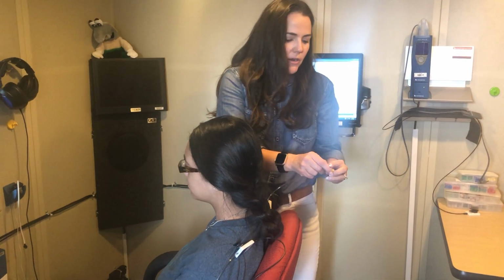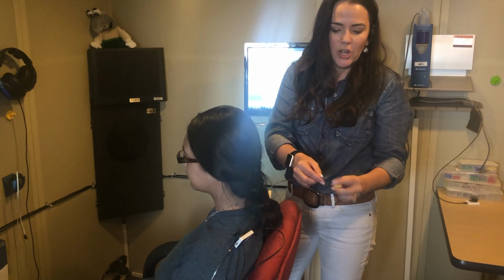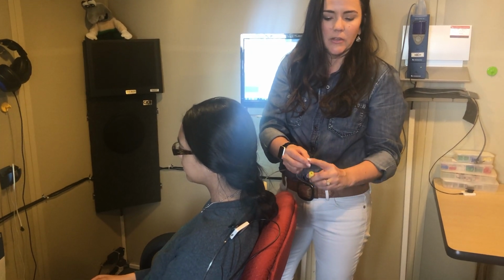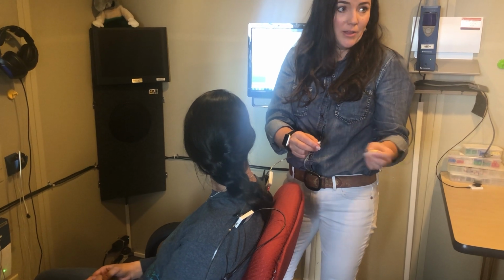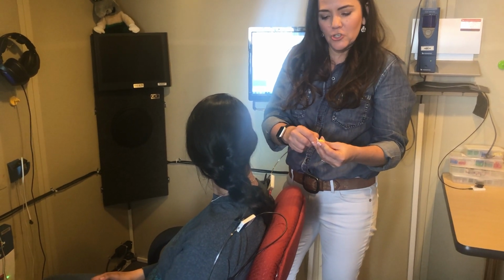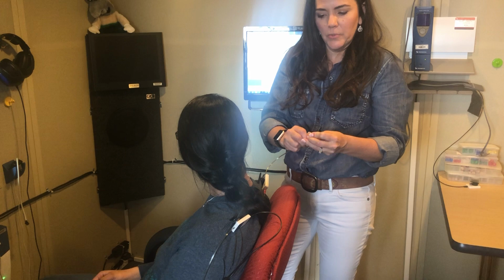Put the insert right here on the end. Now, one thing you have to be very cautious about, when you pull this off, you cannot lose this white piece right here. Don't throw that away. It's very expensive. Just throw the yellow earpiece away.